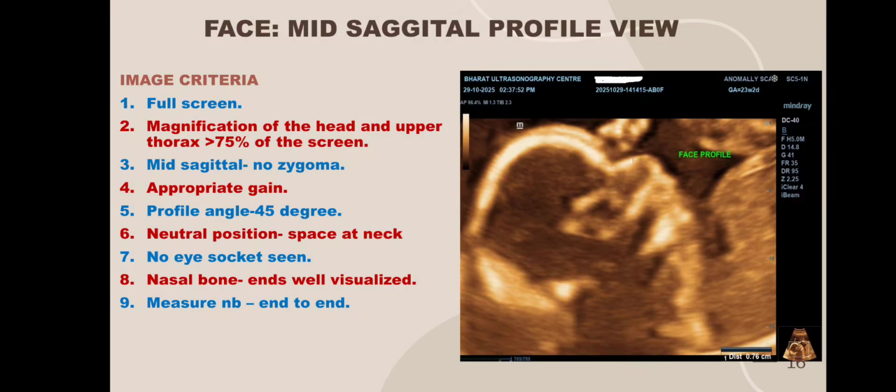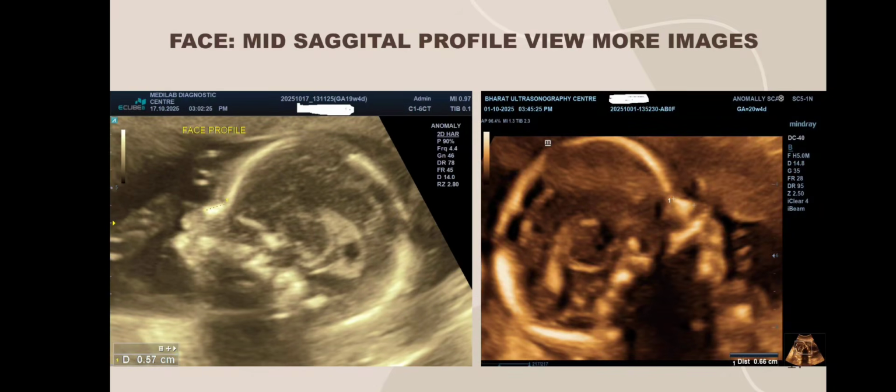No eye socket should be seen. Nasal bone ends well visualized. Measure the NB or nasal bones from end to end. More images of profile view.